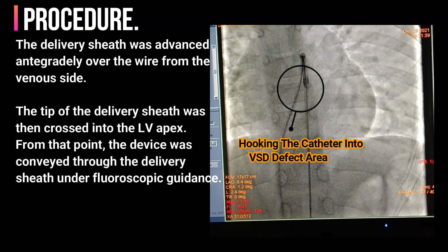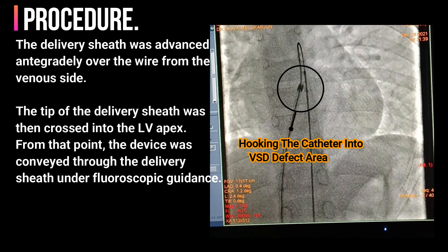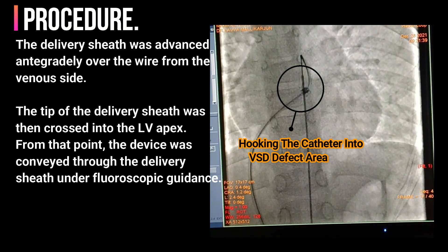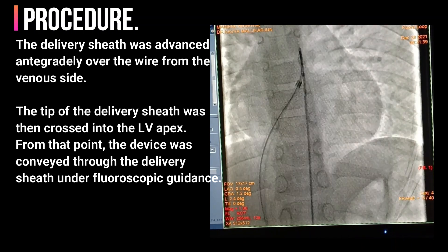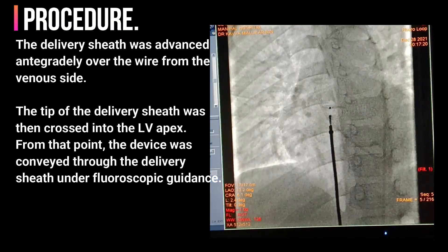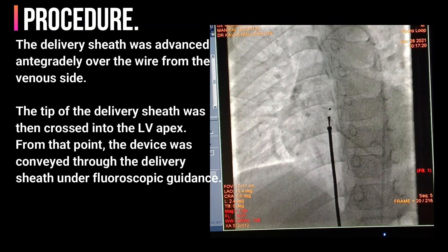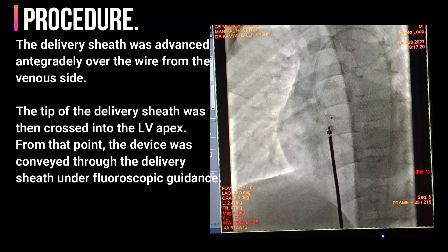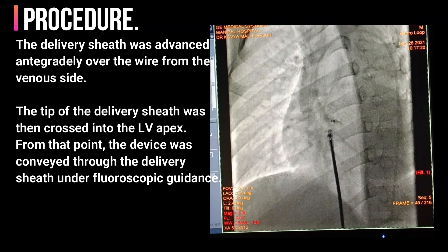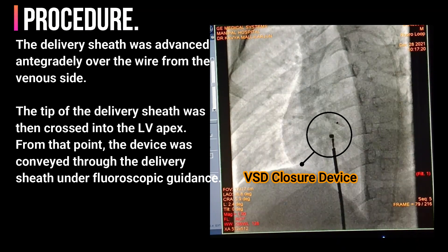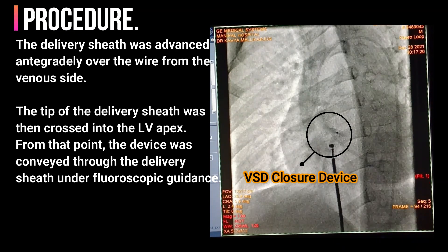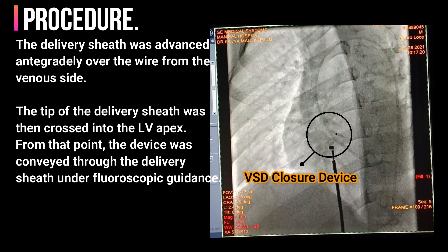The delivery sheath was advanced antegradely over the wire from the venous side. The tip of the delivery sheath was then crossed into the LV apex. From that point, the device was conveyed through the delivery sheath under fluoroscopic guidance.